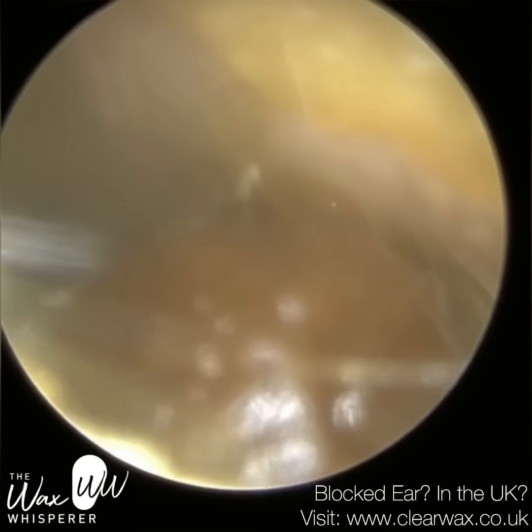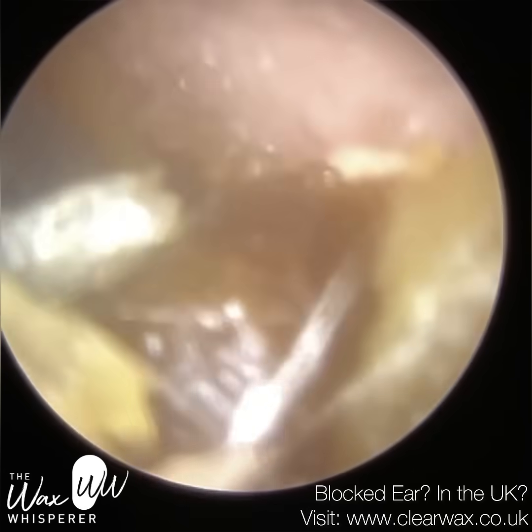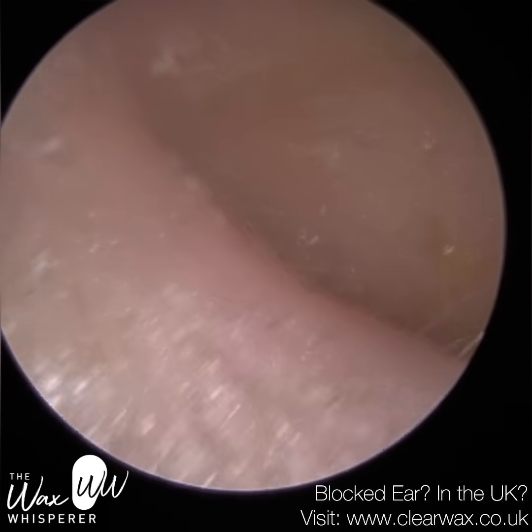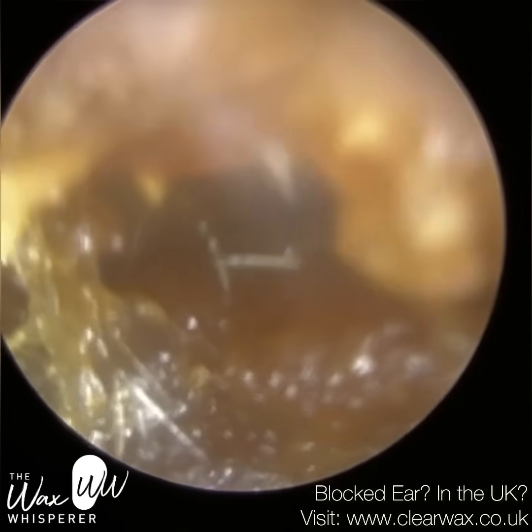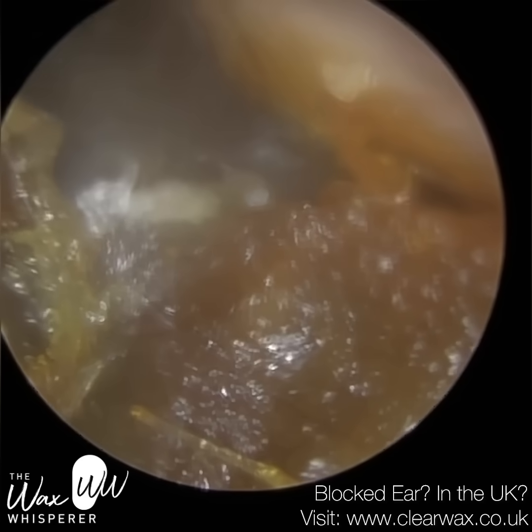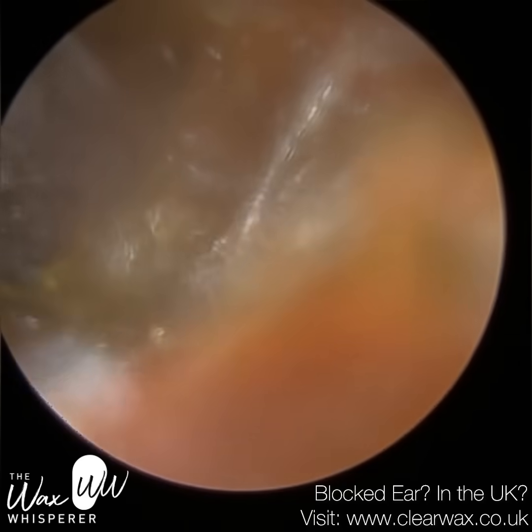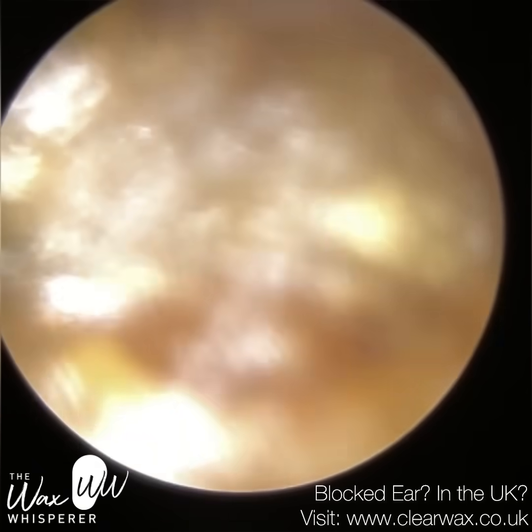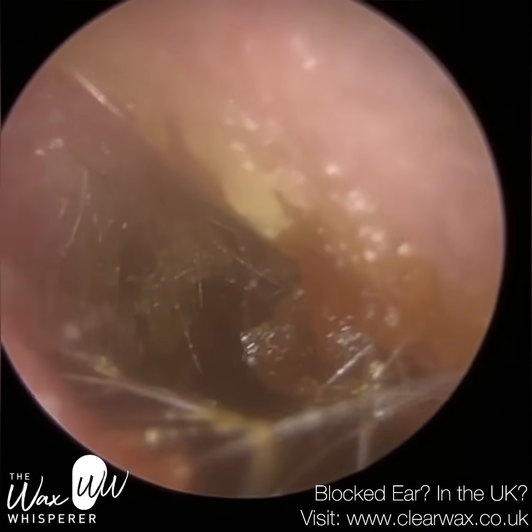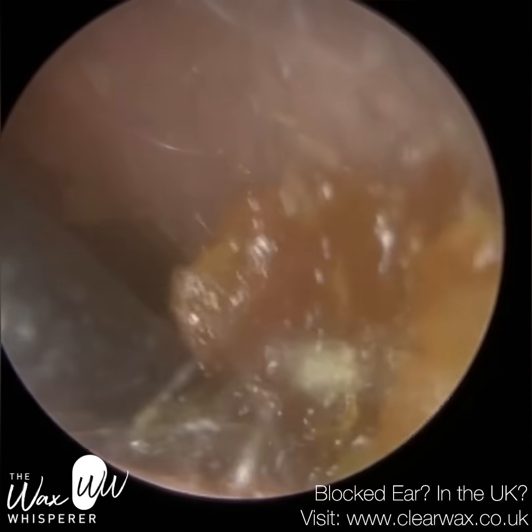This patient has to attend twice a year, and we always try to remove their earwax using manual instruments, trying to avoid suction where possible. That's because this patient has got underlying tinnitus, which can spike and be exacerbated after performing microsuction, so they prefer having it removed manually. It can be a lot more difficult to remove earwax manually, particularly because of the consistency of the earwax and also the ear geometry and anatomy. They've got a very narrow, almost shut entrance to the ear canal, and then once you get in there, it's quite bendy and twisty.